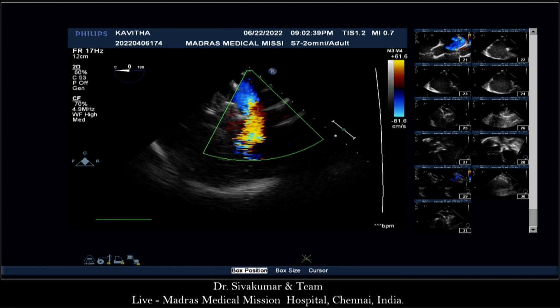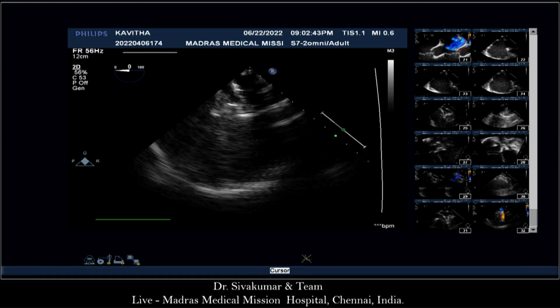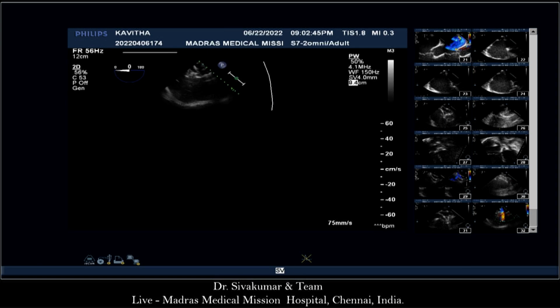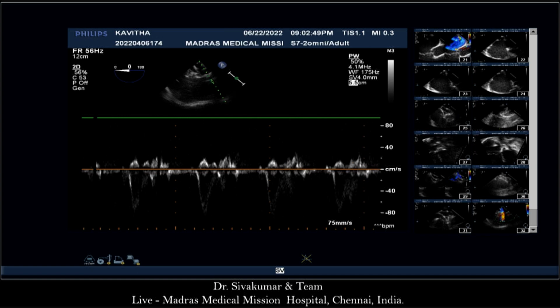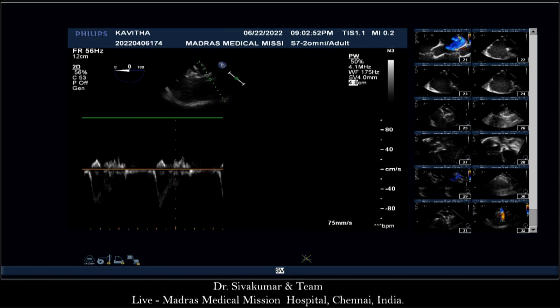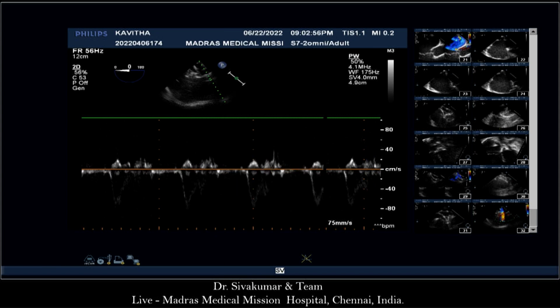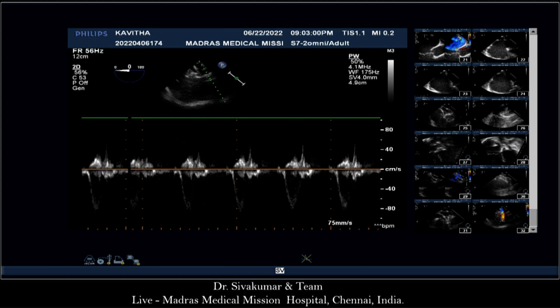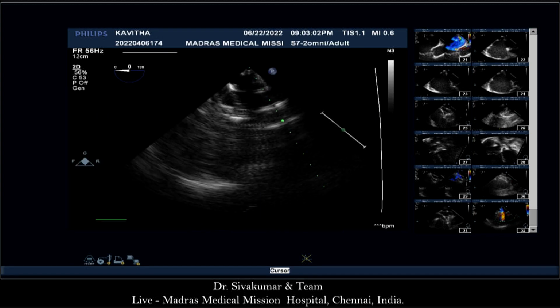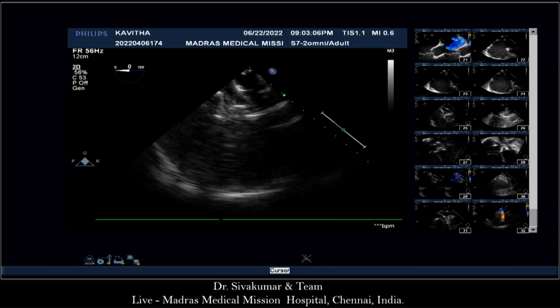The color machine is rubbish. Yeah, correct. Actually, there is some electrical artifact. Doppler, Srija. Pulse wave Doppler. Make it brighter. Last transthoracic, and then we'll jump. Brighter, so that they see the E and A waves. Yeah, we see that, very nicely. Show us the transthoracic picture, and then we'll leave you alone.